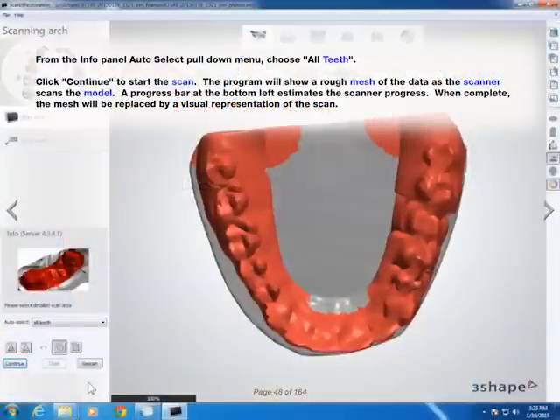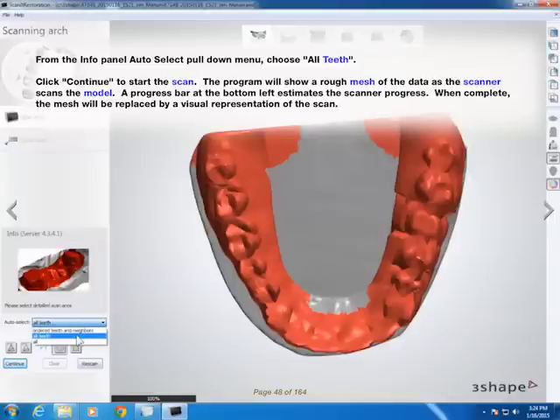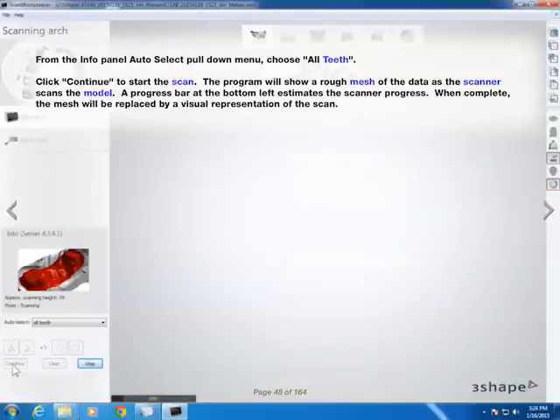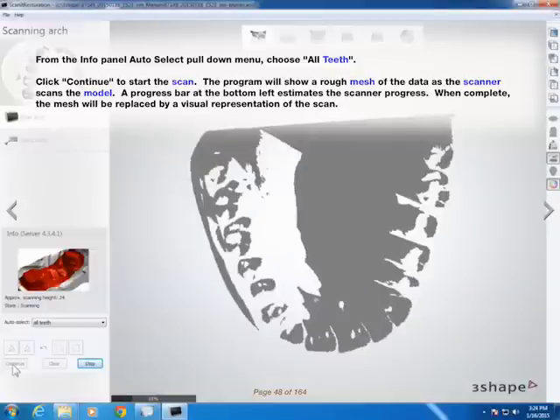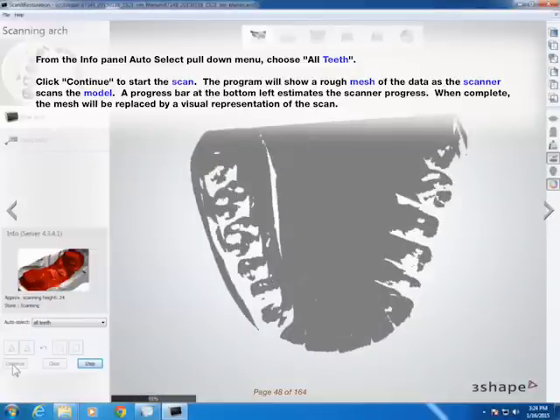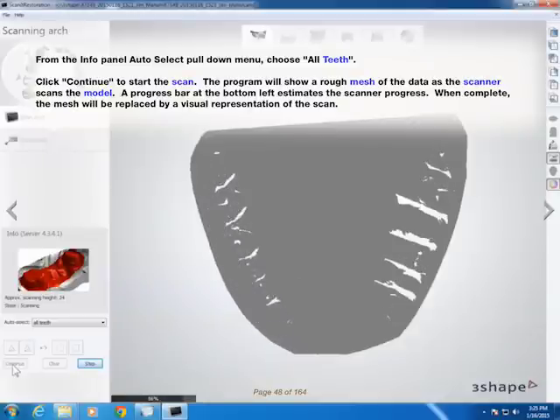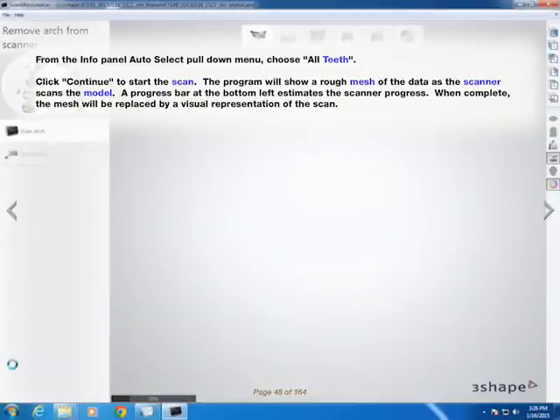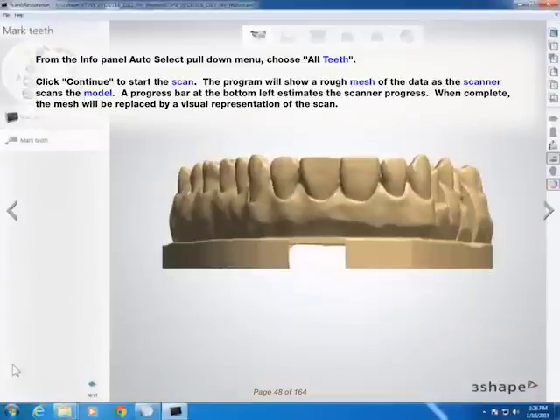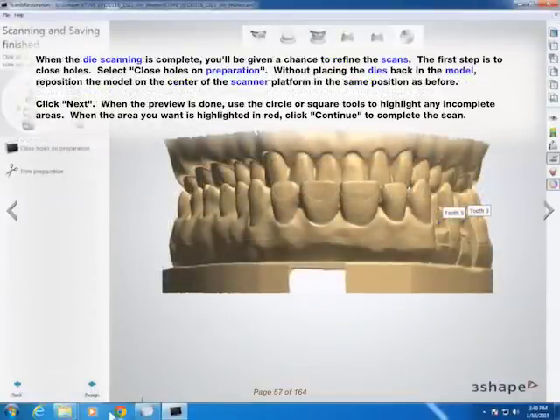From the Info Panel Auto Select pull-down menu, choose All Teeth. Click Continue to start the scan. The program will show a rough mesh of the data as the scanner scans the model. A progress bar at the bottom left estimates the scanner progress. When complete, the mesh will be replaced by a visual representation of the scan.